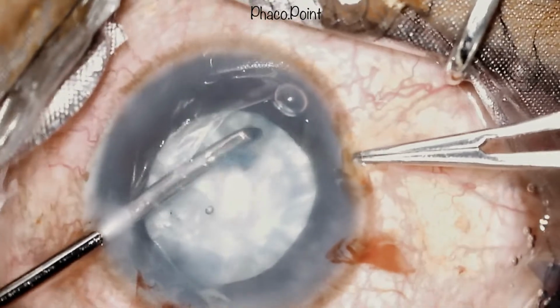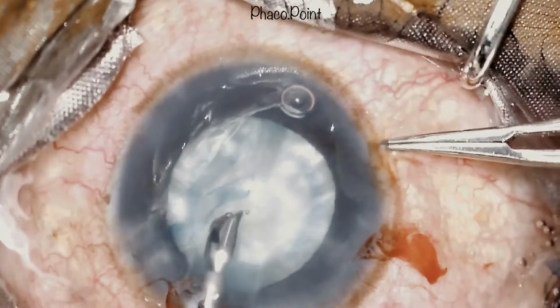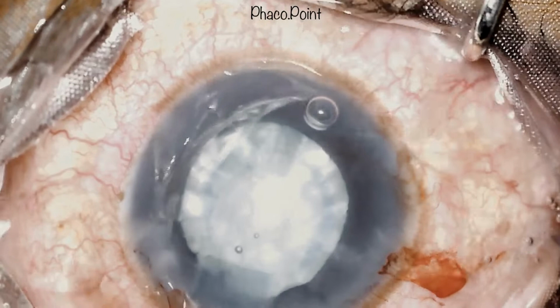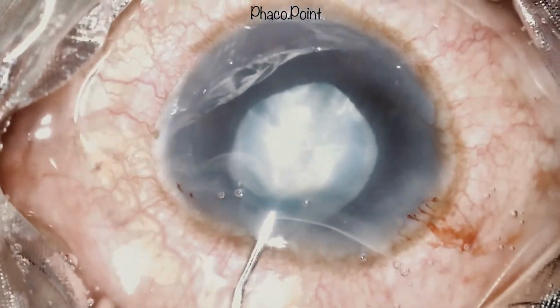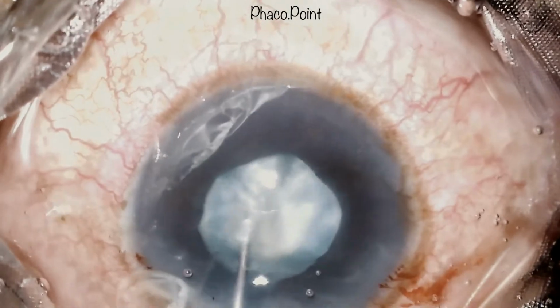As you can see, we've now successfully completed the rhexis, and we have a rhexis that is comfortably sized to allow for ease of phacoemulsification. After decompressing the globe a little to remove some viscoelastic, I perform a gentle hydrodissection.